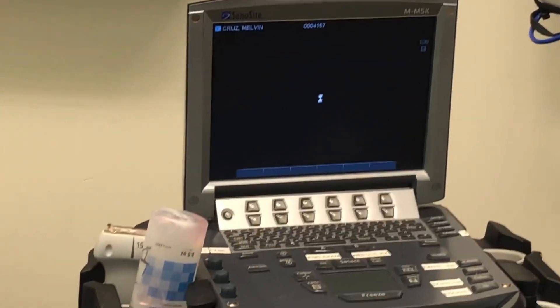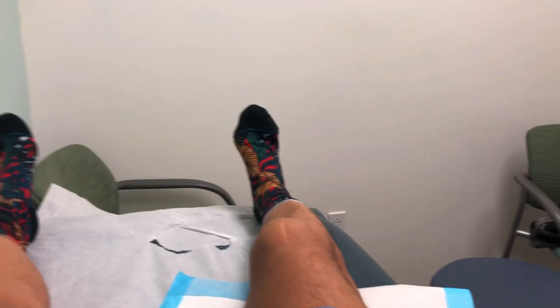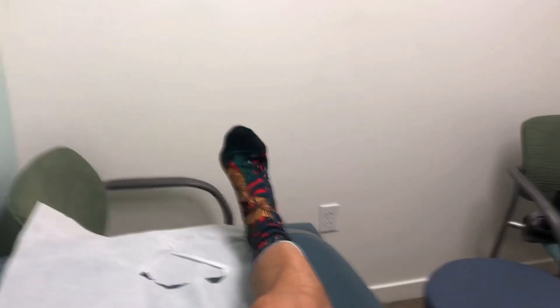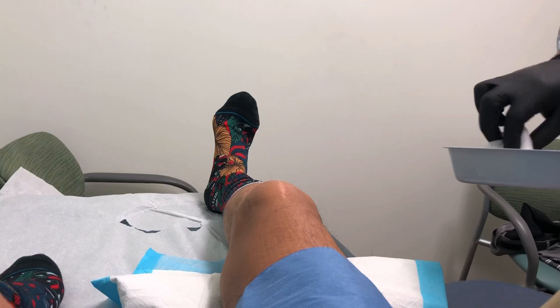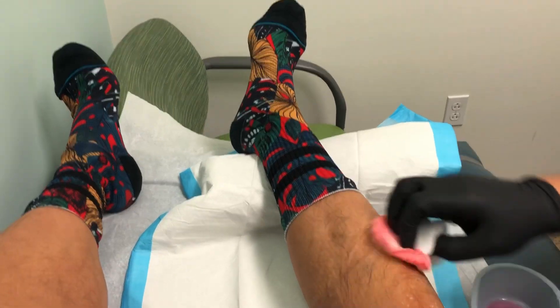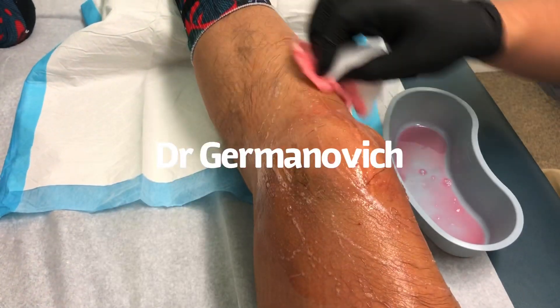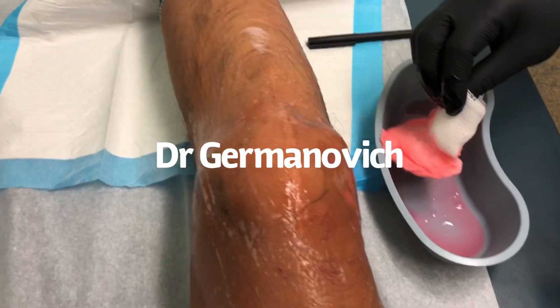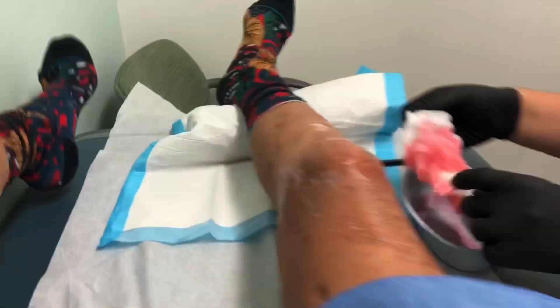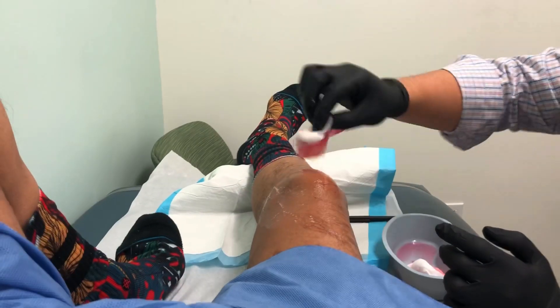We've got hibiclens here to keep things nice and clean. The Sonosite ultrasound — musculoskeletal ultrasound — is ready. We're going to do it in this position lying down. I've got my stance socks, never leave home without them. We're going to mark up the anatomy here — a little externally rotated so that I get the patella aiming at the sky. We've already marked the spot.